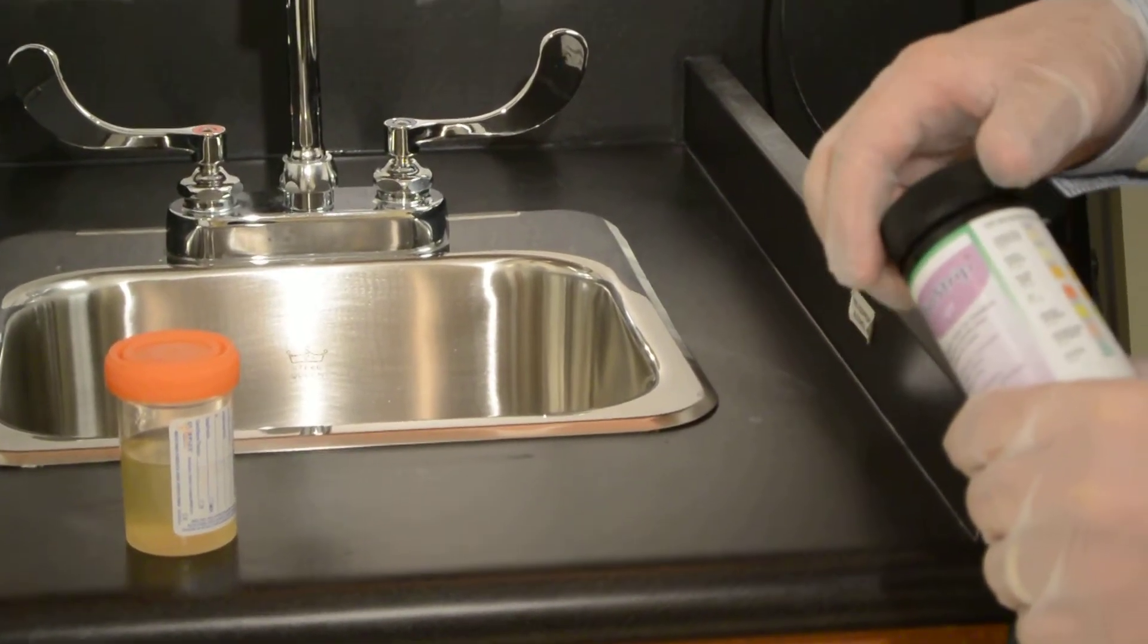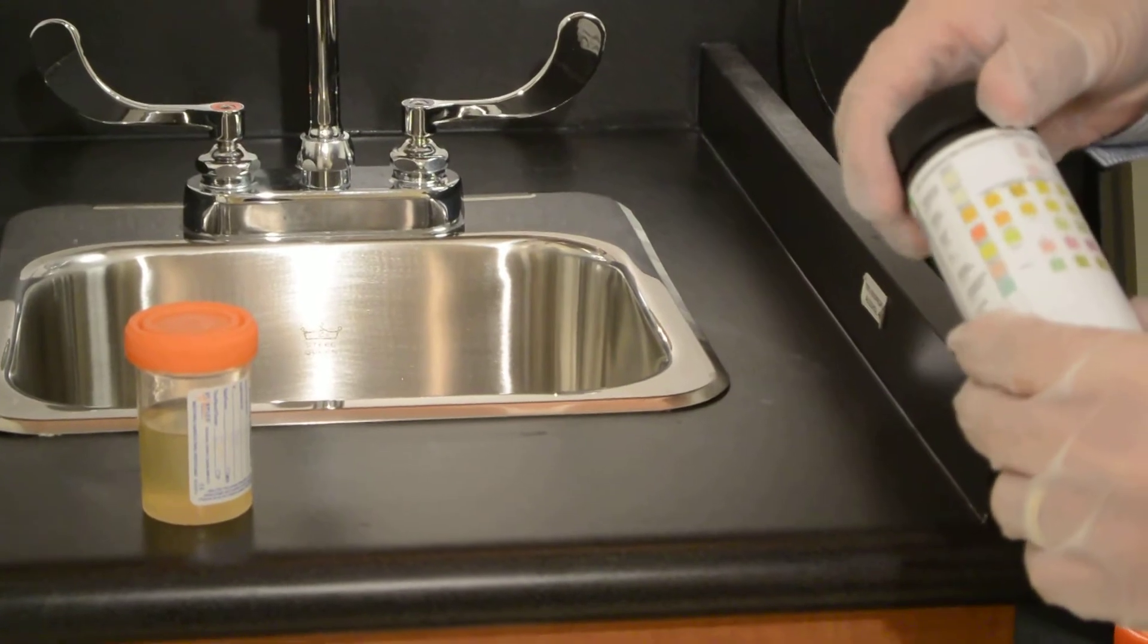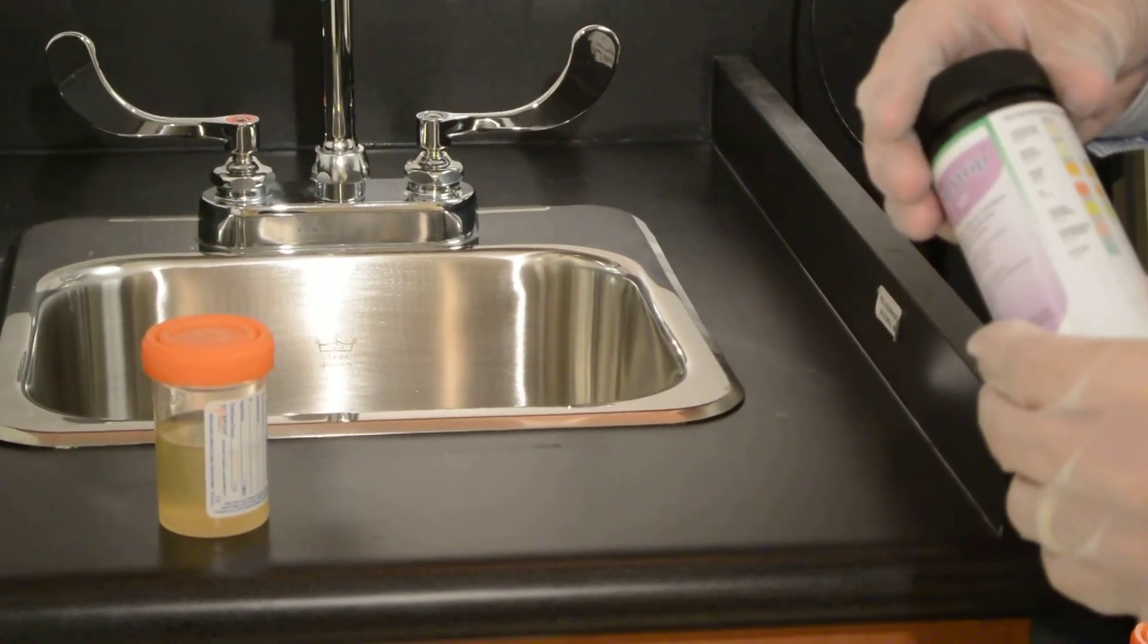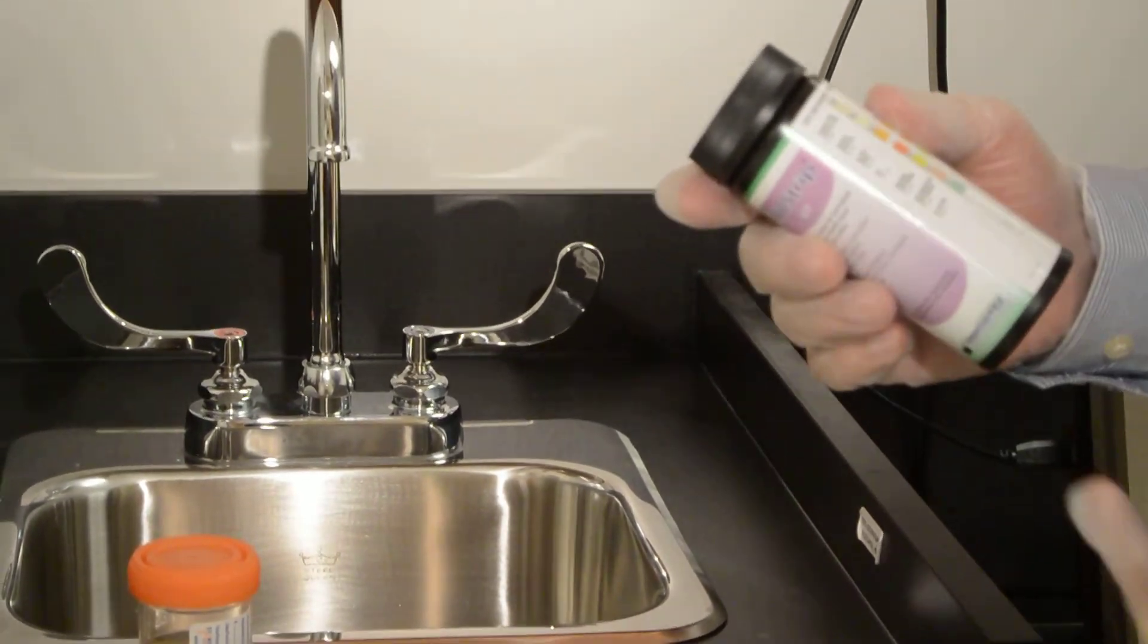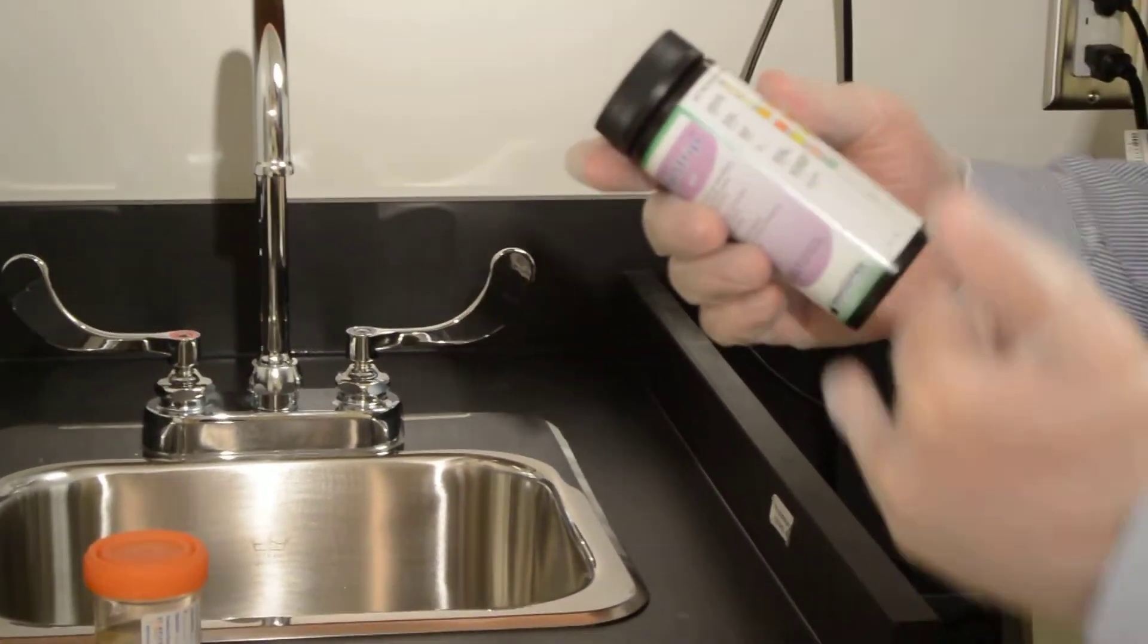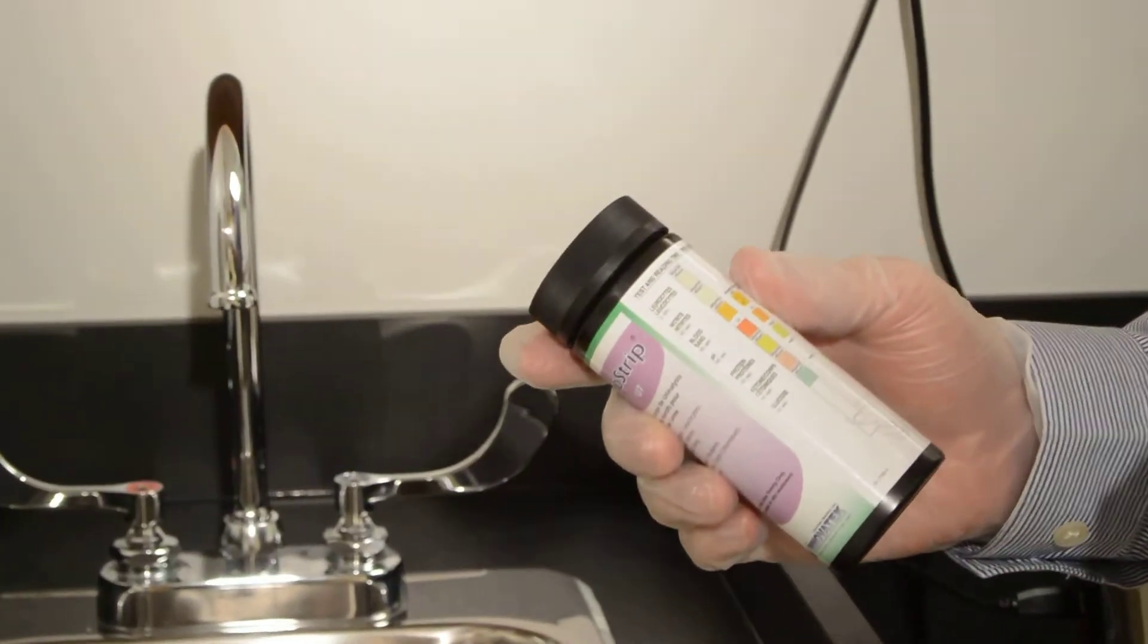In this presentation, we'll learn how to do a urinalysis test, testing the urine for different compounds: leukocytes, nitrites, blood, pH, proteins, ketones, and glucose.